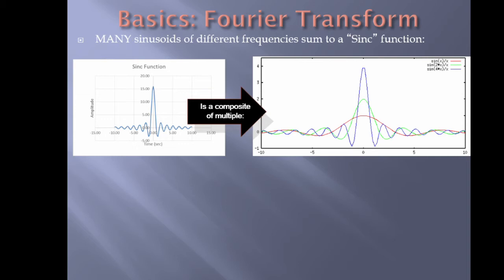When we collect MR data, this is what it looks like. If you plug an oscilloscope into the machine when you're taking an echo, it looks like that. Or it looks like this.